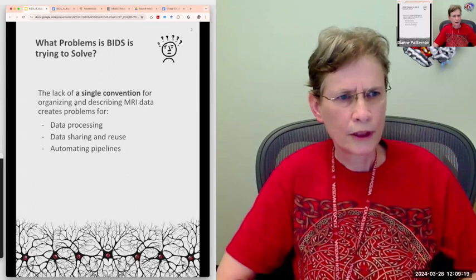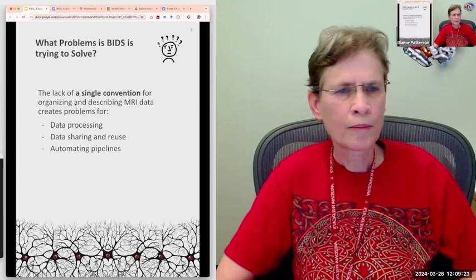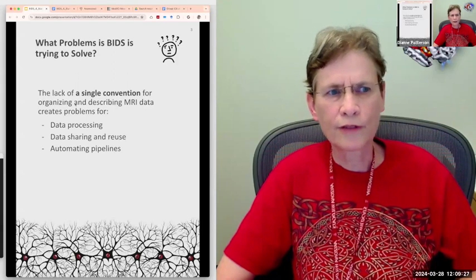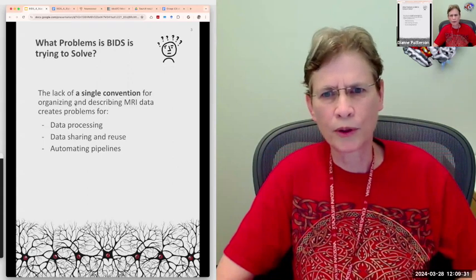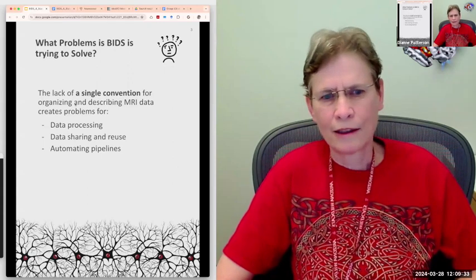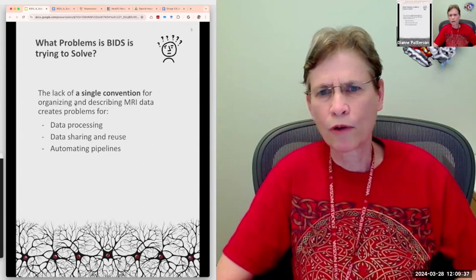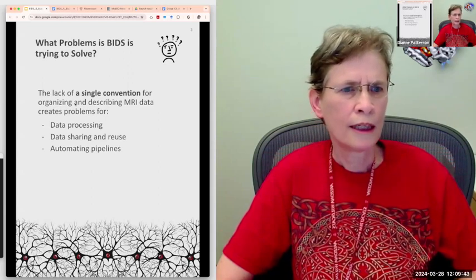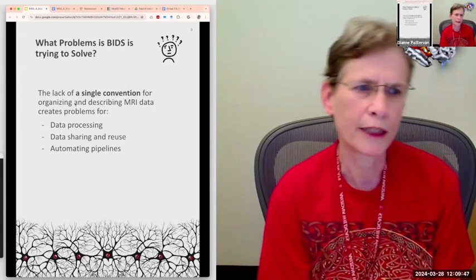All right, so the problem that we've had for many, many years in neuroimaging is the lack of a single convention for organizing and describing MRI data. People organize and name their subjects however they want. They make subdirectories that make sense to them, and they name the files the way that they want. And that's fine until you want to share it with somebody else.